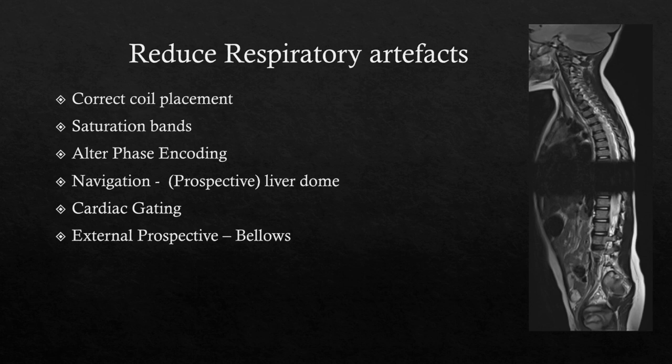So you could alter the phase encoding. That does have time penalties, which is a disadvantage, especially when you're imaging pediatrics. It's always a consideration.